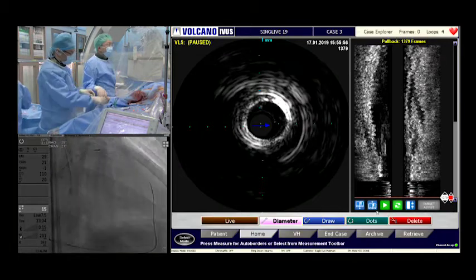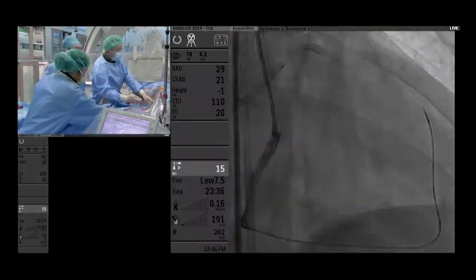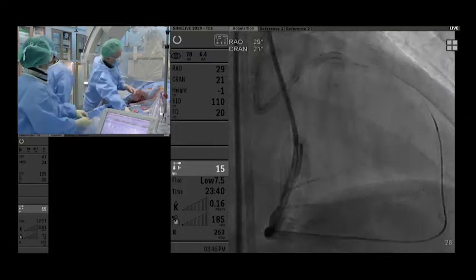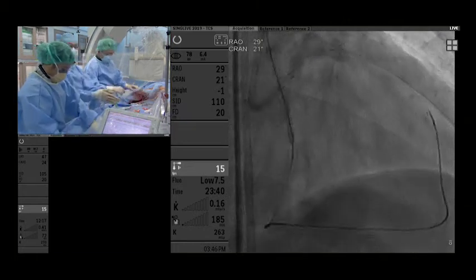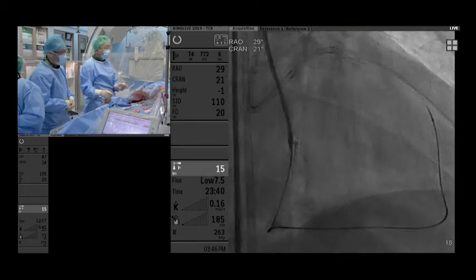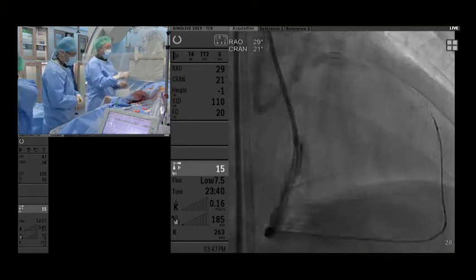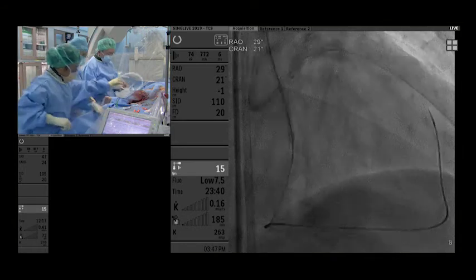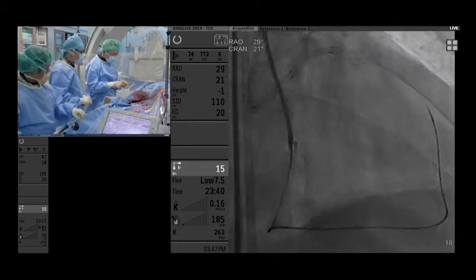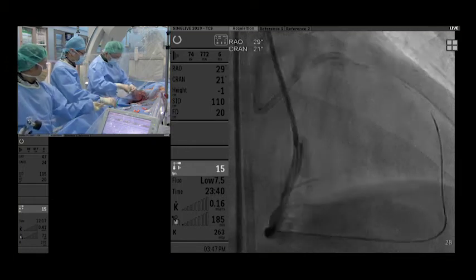2538, alert master, please. Yep, let's open. 2538. Dr. Oshii, so right now you plan for the stent implantation? Do you plan for the stent implantation now, or just balloon first? I put the stent because I made 2.5 balloon inflation, checked IVUS, and at this time we have a nice landing zone, so I put the stent and finish the case. The stent size is 2.5 first, and maybe the proximal portion needs post-dilatation with 3.0. And then I put the 3.0 at the proximal LAD, suggested by the IVUS vessel diameter.